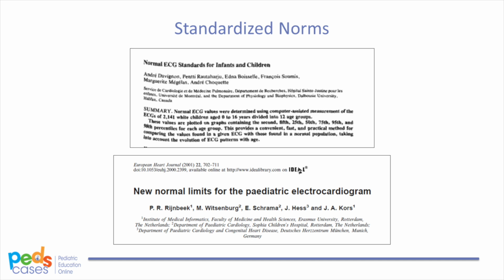In 2001, Rijnbeek and colleagues published new age and gender-based ECG normative data that are now used in clinical practice and will be used for the majority of this podcast. These norms are available for free online. Regardless of which reference you use, normative data should always be referred to when interpreting pediatric ECGs.